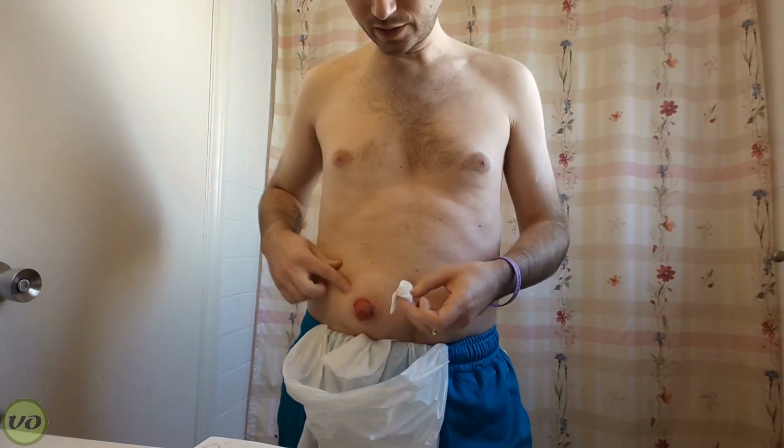And just clean around the area. A lot of the times you'll get residue or even a bit of lint and stuff collecting right along the edge here. You can see a little bit here. You can just use the adhesive remover wipe to get rid of that.